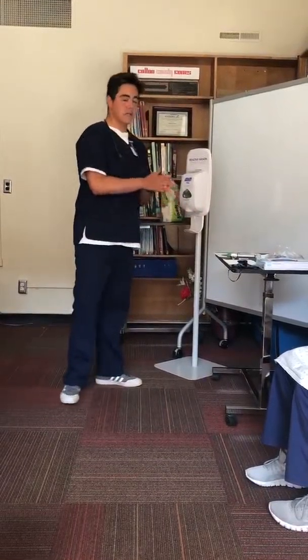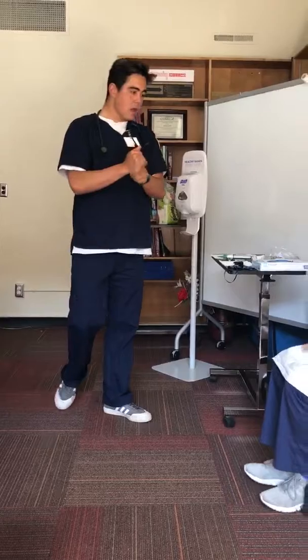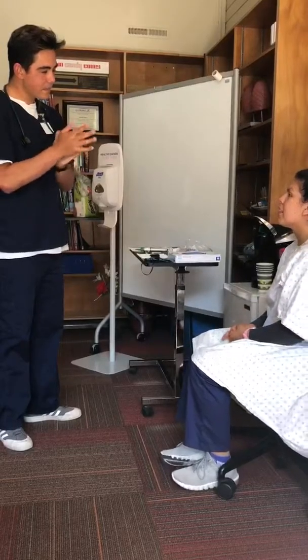So after this, we're going to go ahead and sanitize our hands for 15 seconds or more as we enter the patient's room. Hello, my name is Nolan Gugazal. I'm a respiratory therapist with the Hartnell College Respiratory Care Program. What is your name? Neftali Lazaro.